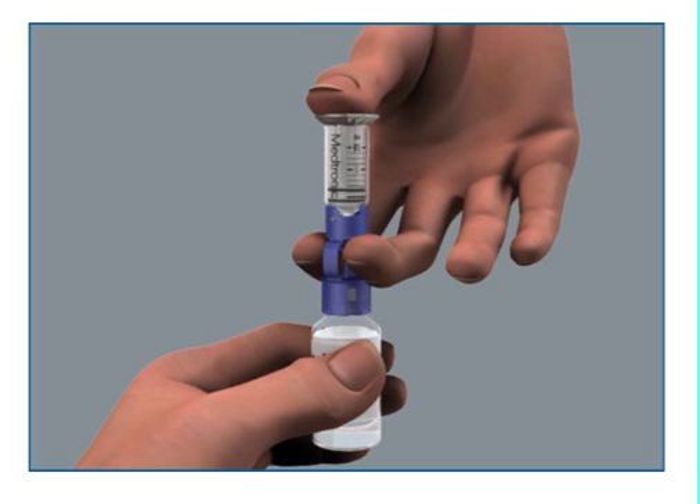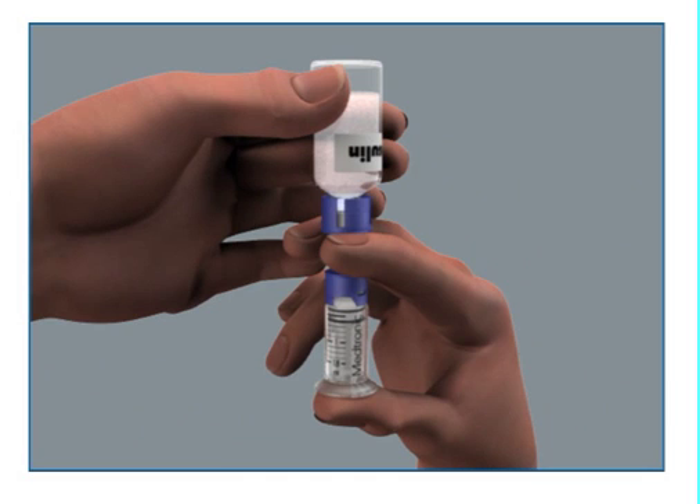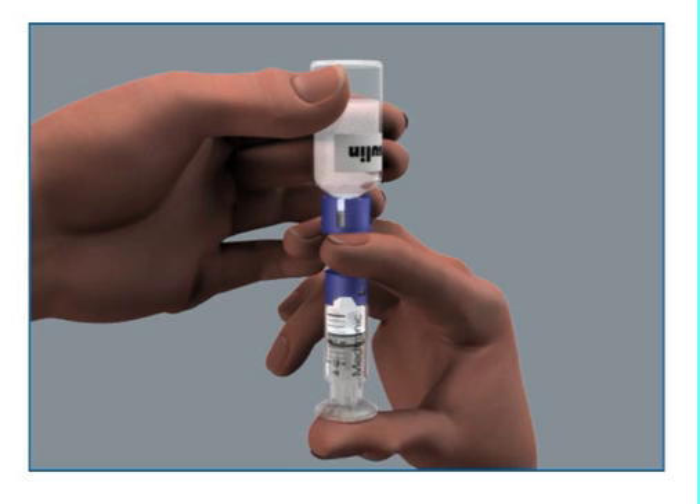Continue to hold the plunger with your thumb. Flip the vial over so the vial is on top, and make sure you are holding the vial with your other hand. Slowly release your thumb pressure from the plunger rod and the reservoir will start filling with insulin.